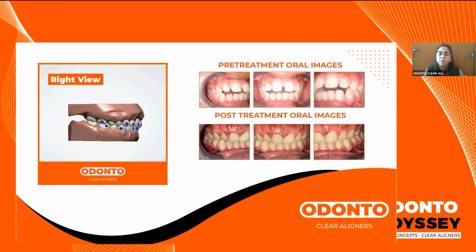This is just something that we program into your treatment plan to ensure that the movement takes place up to the desired amount. We program this overcorrection to ensure that in cases wherein we have a large malocclusion, we are able to close it in a more favorable manner. So this is one of the more favorable cases for correction of the malocclusion using aligners.